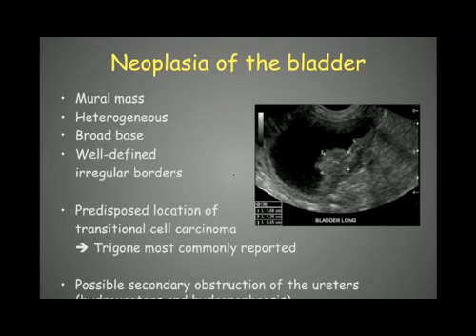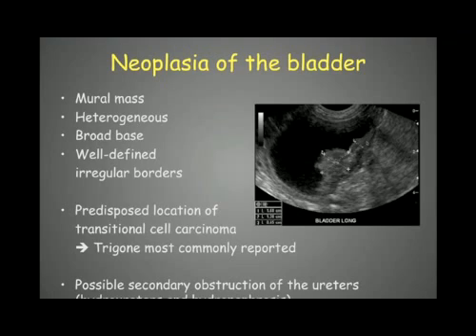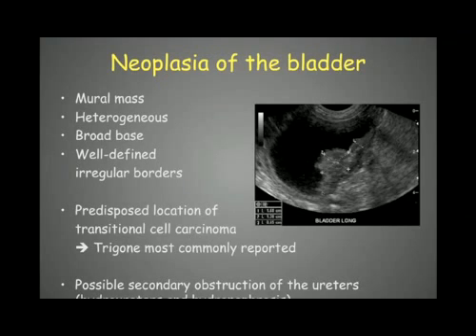Neoplasia of the bladder is quite common. It will appear as a mural mass — generally quite heterogeneous with an irregular surface and a broad base. The broad base is quite an important criterion to differentiate it from polypoid cystitis, where we have pedunculated masses. When it has a broad base, it is very suspicious of neoplasia. Most of those bladder tumors are transitional cell carcinoma, with a predisposed location at the bladder trigone.